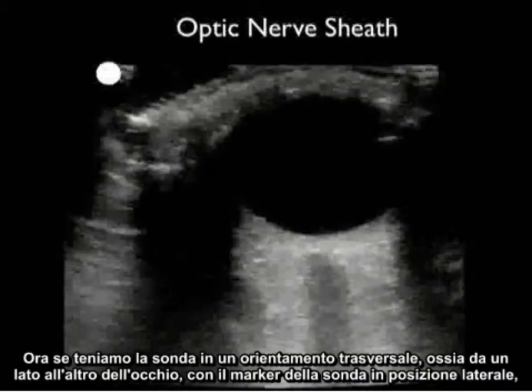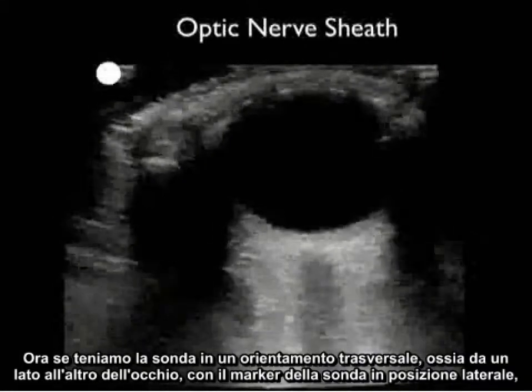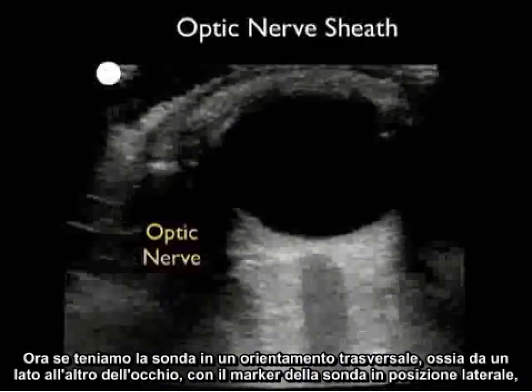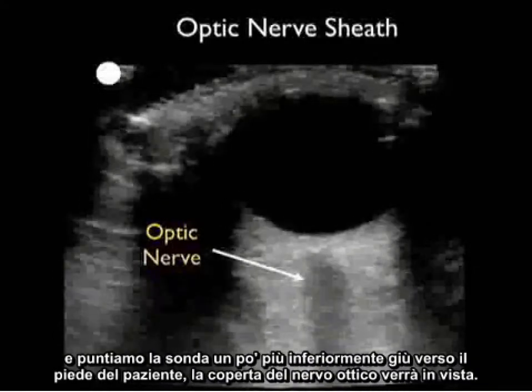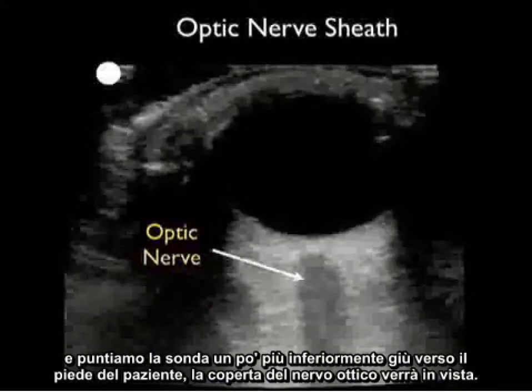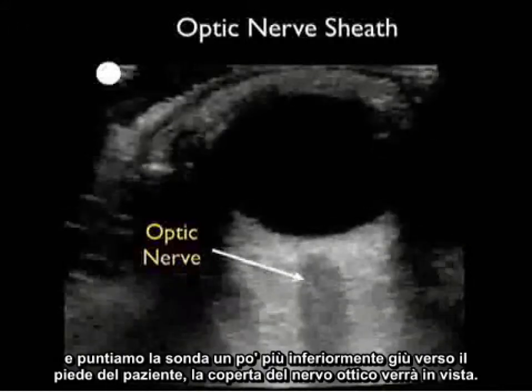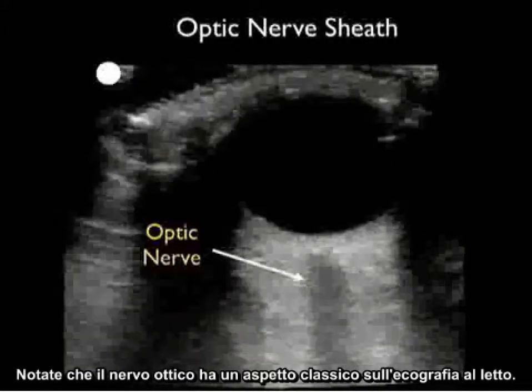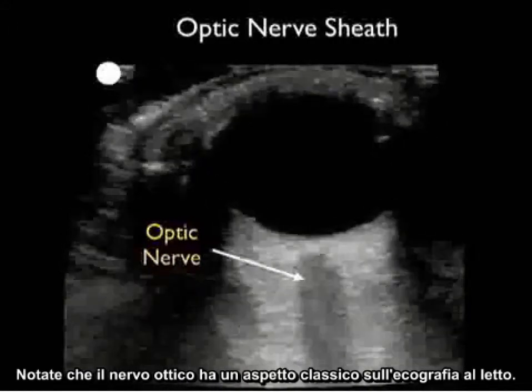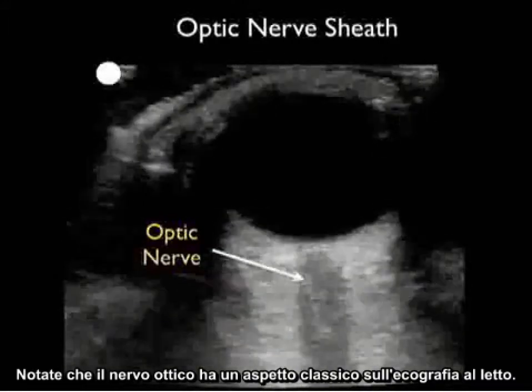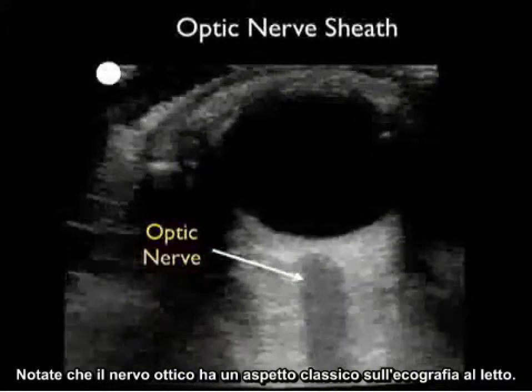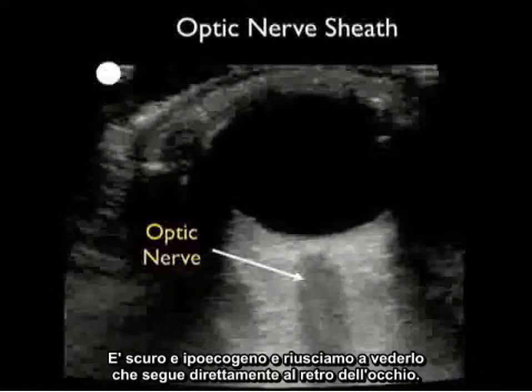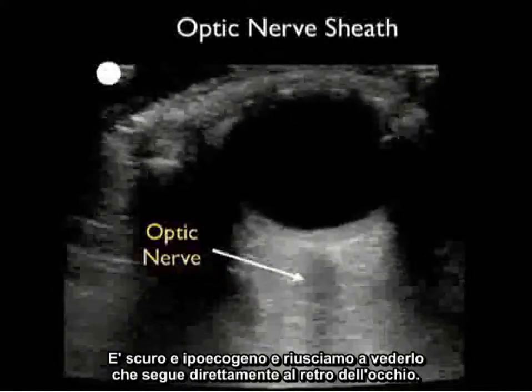If we have the probe in a side-to-side or transverse orientation across the eye with the probe marker lateral and aim the probe a little bit more inferiorly down towards the patient's foot, the optic nerve sheath will come into view. Note the optic nerve has a classic appearance on bedside ultrasound — it's dark or hypoechoic, and we can see it leading right up to the back of the eye.